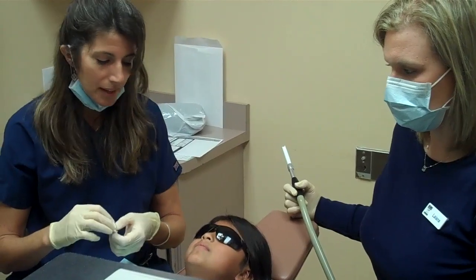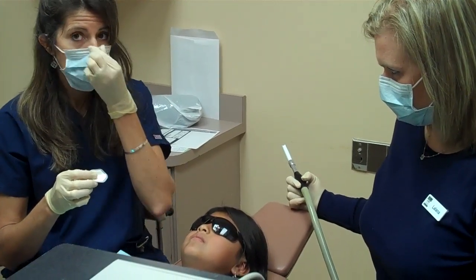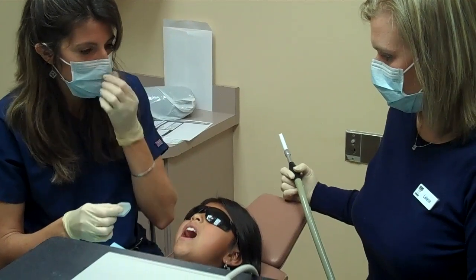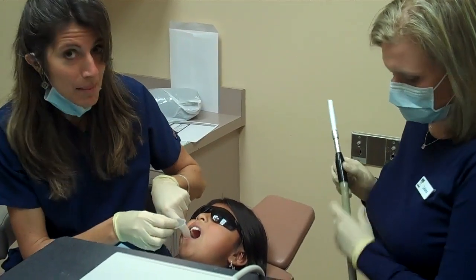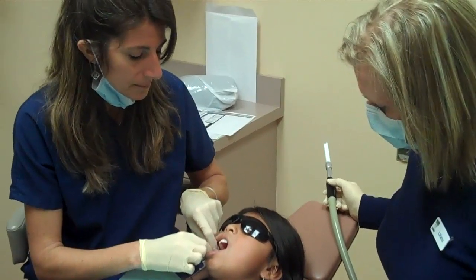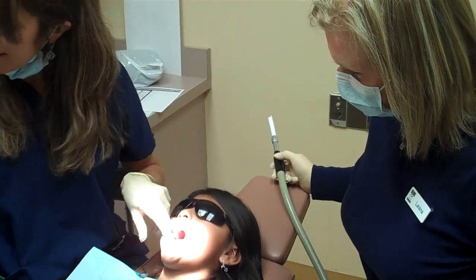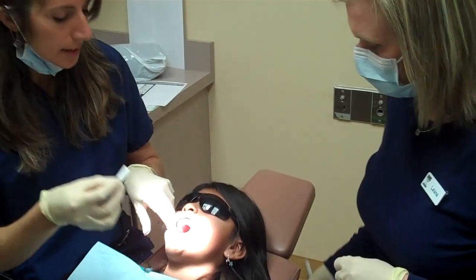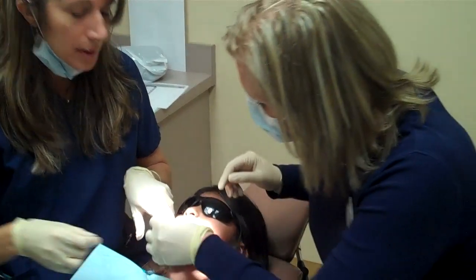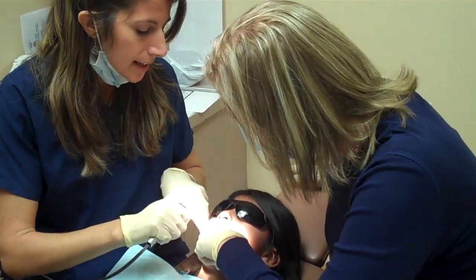So what we're going to do is first take a little dry pad and put it on the inside of her cheek to help keep her cheek dry. So it goes right onto her cheek. We're going to get the light in there, and Liana is going to hold a little cotton roll to keep the tongue out of the way. We're going to try to keep everything dry so that the sealant gets a good stick.